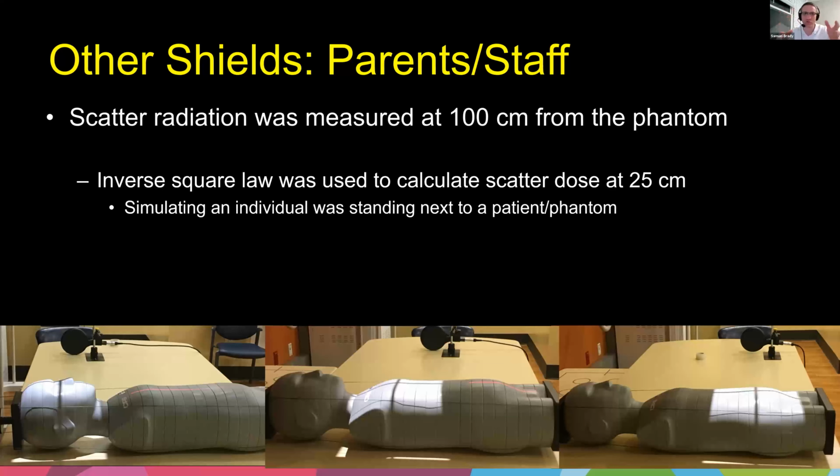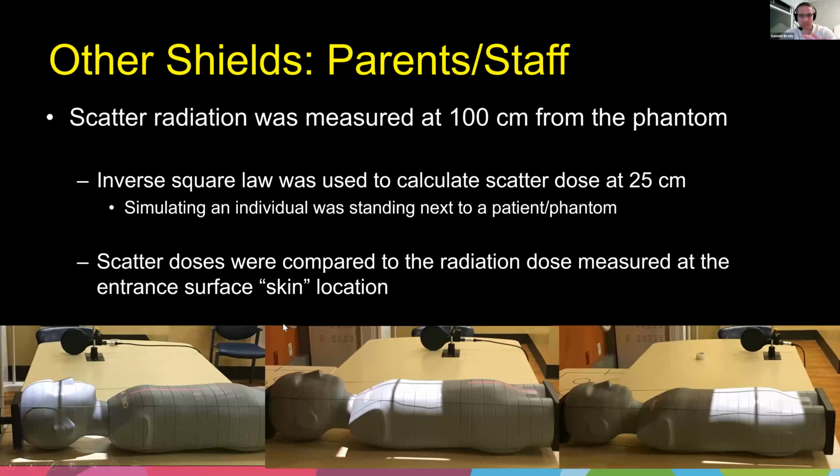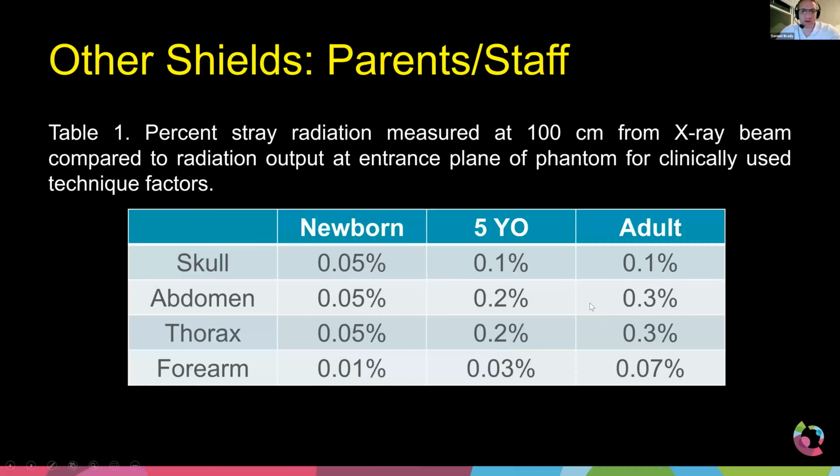about where you would be standing, if you were a staff member or a parent or a caregiver, if you were helping, say, hold a patient, or if you were just sitting there talking to them, helping them stay still. All right. So here are the results from this.